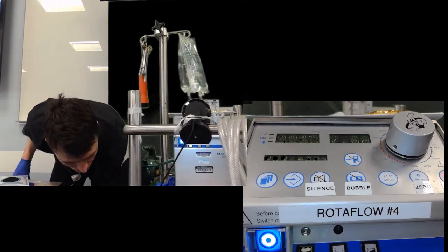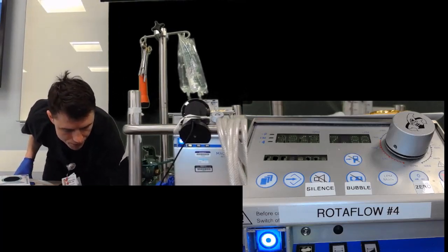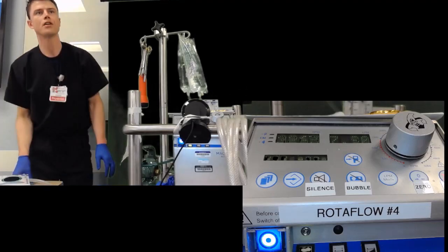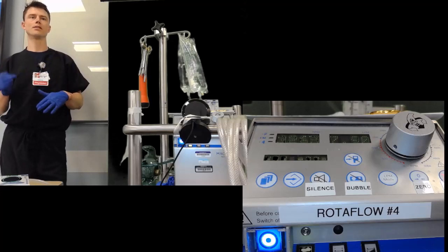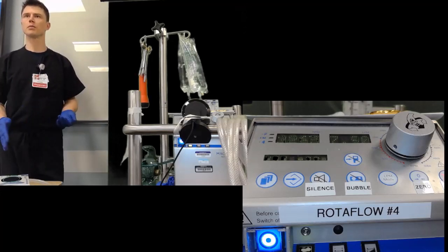All right, so we turn it on, and we can set the temperature much like we would any other device down here. So you should look at what the temperature is set at. If the temperature is like 36 degrees, 37 degrees, and the patient's temperature is different, you'd be asking why. It should be the same. It's very efficient at heating or cooling the patient down.